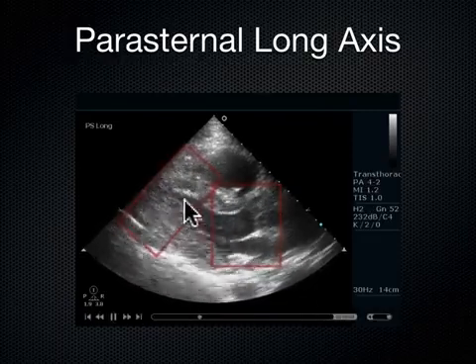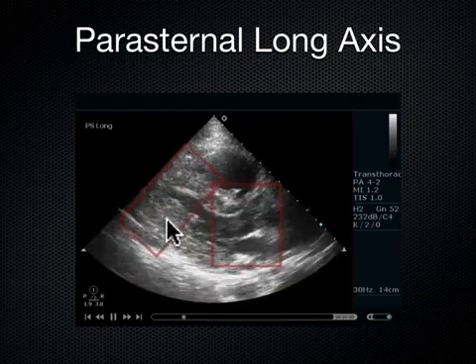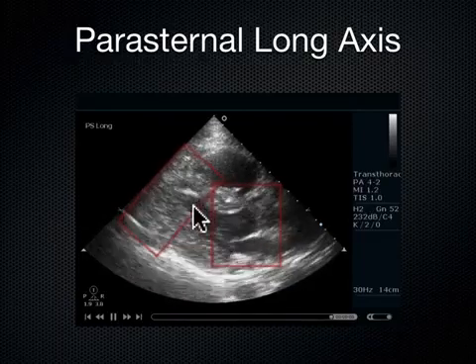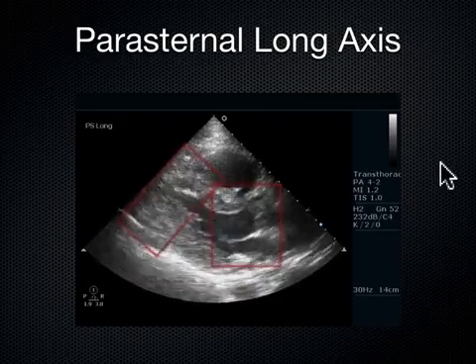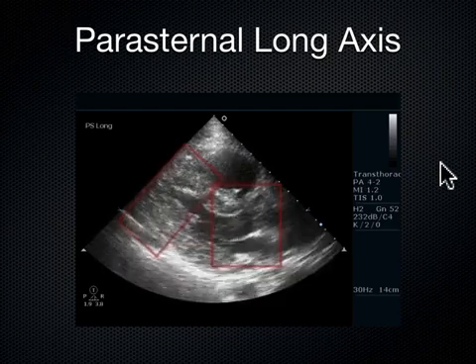And then we look at the chamber size of the left ventricle here, and we see that interventricular septum and that posterior wall not really squeezing together very much. In fact, not really moving at all. Here's another thing I'm noticing. The right ventricle is up here. It's actually larger than the left ventricle. And in certain settings, this is a problem because when we see somebody with a large right ventricle, normally the right ventricle is only 2/3 the size of the left ventricle.